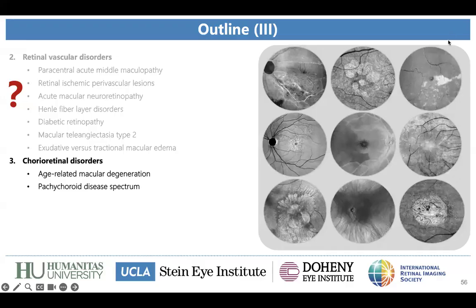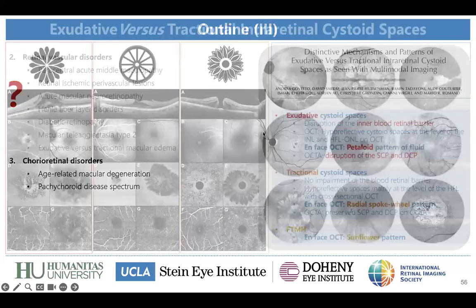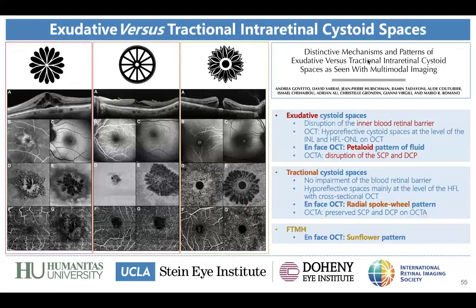Well, I just loved your final explanation about the pattern in the cystoid space. We were just yesterday discussing a patient, and we were trying to figure out if this was exudative or tractional fluid. And now I want to check again and look for it.